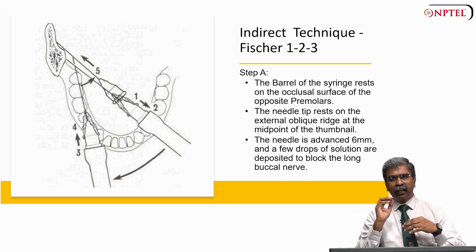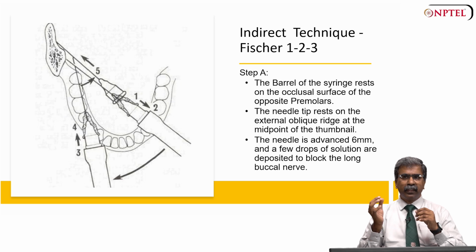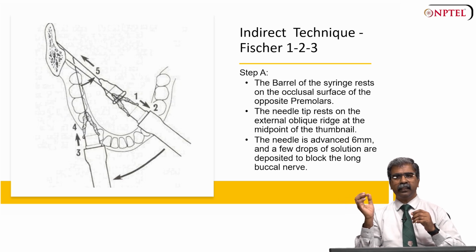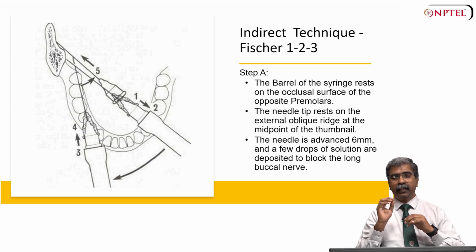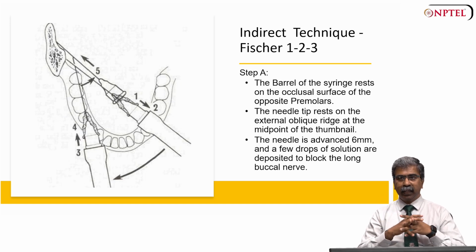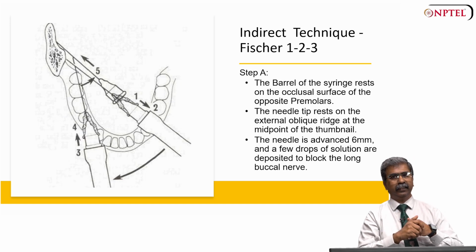Step A involves the syringe positioning, where the barrel of the syringe is positioned to rest on the occlusal surface of the opposite premolars. This provides stability and a reference point for the injection. And the needle tip is placed on the external oblique ridge at the midpoint of the thumbnail, and this ensures accurate alignment with the targeted anatomical structures.